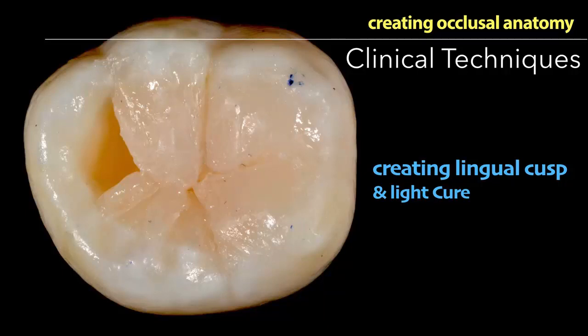Cure it properly; you can even over-cure it, there's no harm in that. The only thing is that the curing light should never touch the occlusal surface. Keep it a bit away, because it can contaminate the light, and the efficiency of the light will decrease after these procedures because you're doing a lot of things in clinics.